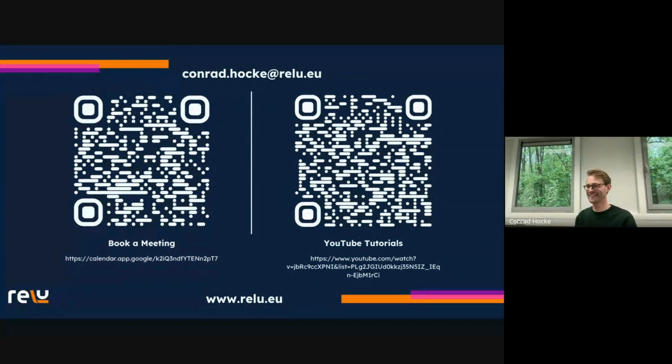All right, thank you, Antoine. And for Emil, as of now, we're not working with specific implants. Maybe later on, we will be adding libraries of specific implants, but for now, the implants that we place are just cylinders that have a specific diameter and a specific length that are usually found in implants. We really want to make it as general as possible to bring it to as many people as possible to see, okay, now we have an implant that fits this description, we can use it, but we don't want to be limited by specific implant libraries as of now.